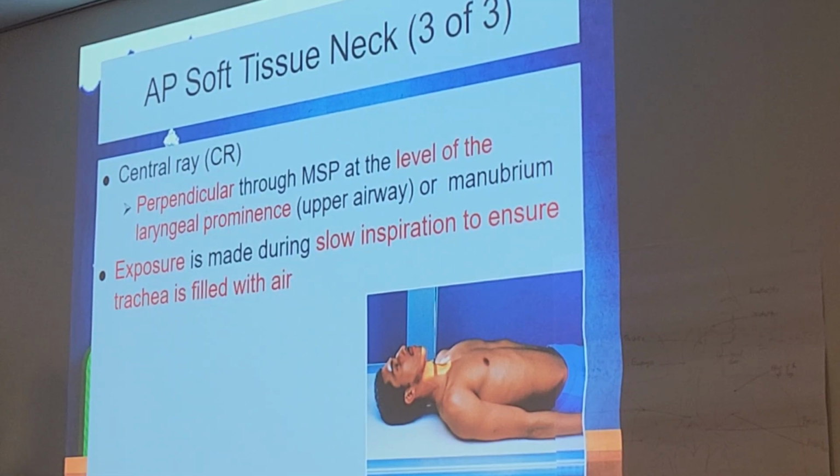So we tell the patient to do what? Take a slow breath in, breathe out slowly, and you catch them as they're breathing in. Key aspect on that exam. So you'll probably see some text where they tell them to hold their breath, and they'll get a really bad picture because they're not getting that fully inflated air-filled trachea. It's got to take place during the actual inspiration.